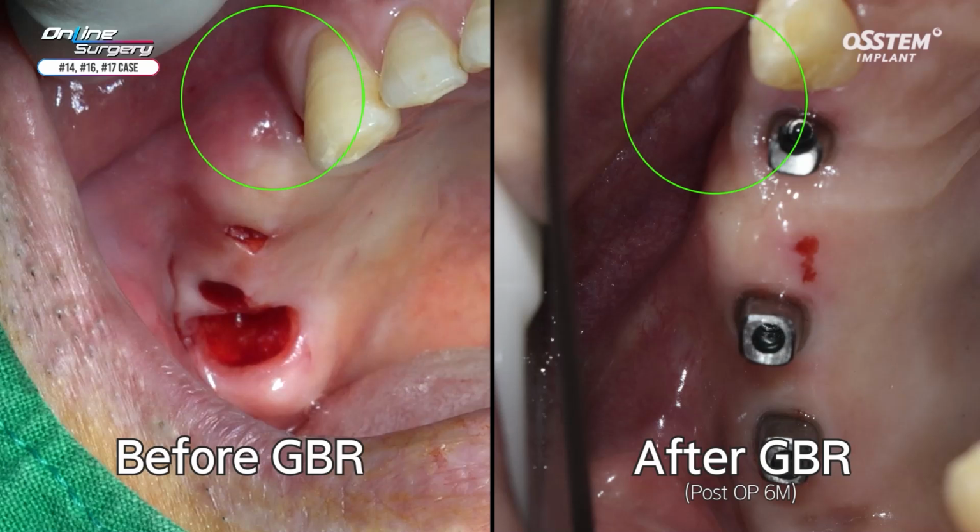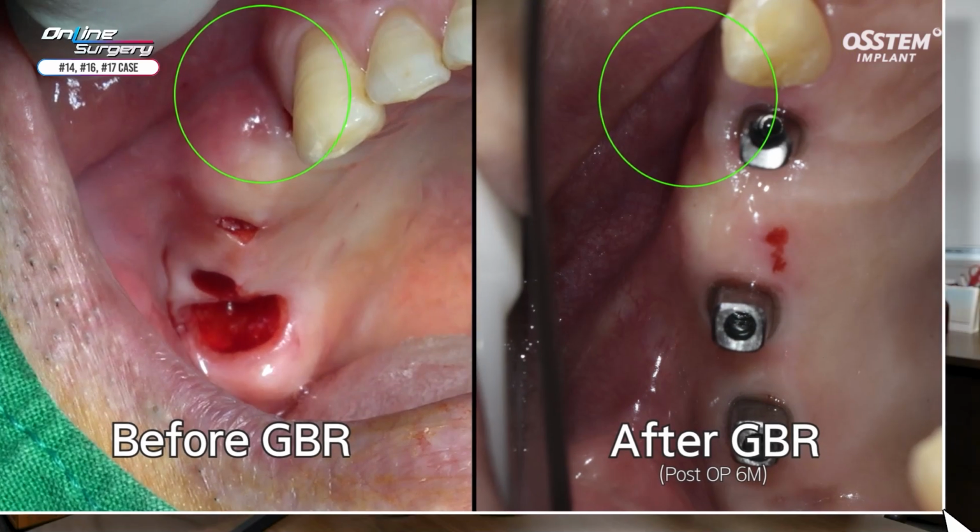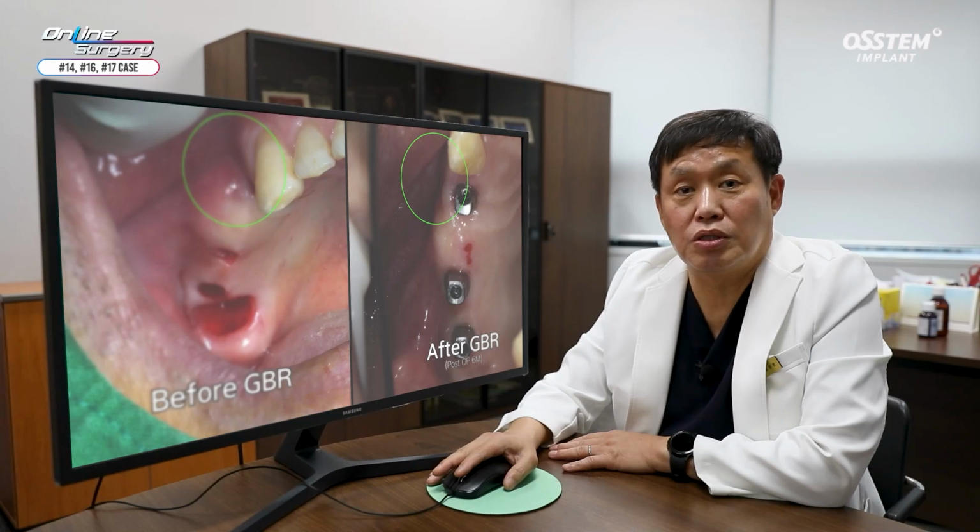Today, the case involved a simple GBR using AOS collagen in the buccal bone defect area in number 14, along with a crestal approach and implant placement in number 16 and 17 using OneCAS kit.